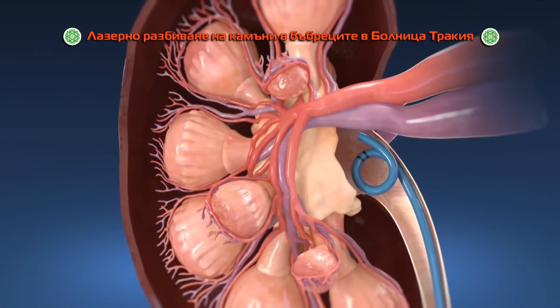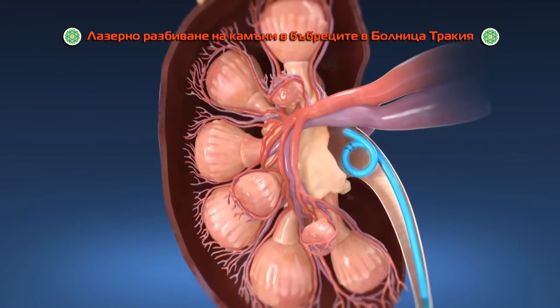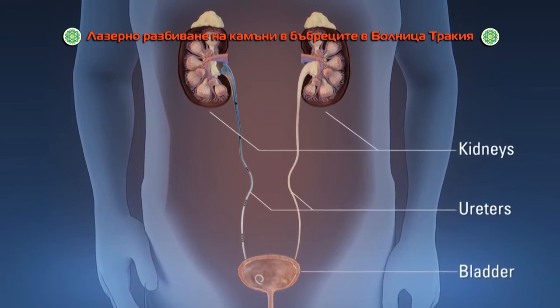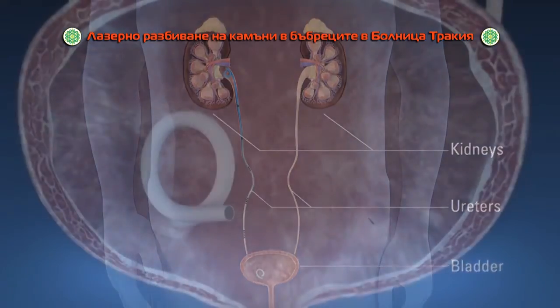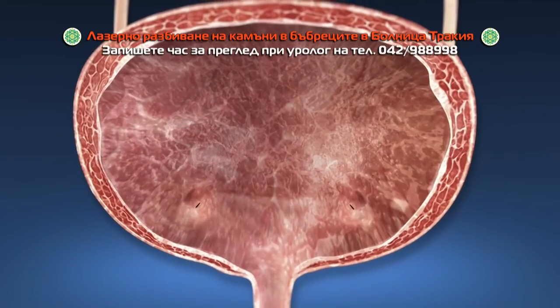At the end of the procedure, your doctor may insert a small plastic tube called a ureteral stent in your urinary tract to help control swelling and allow the kidney to drain urine. The stent typically remains in your body for 4 to 7 days and is then removed during a follow-up appointment.